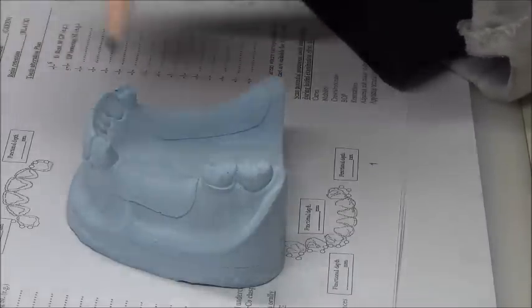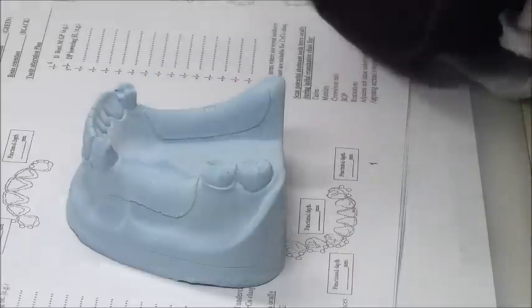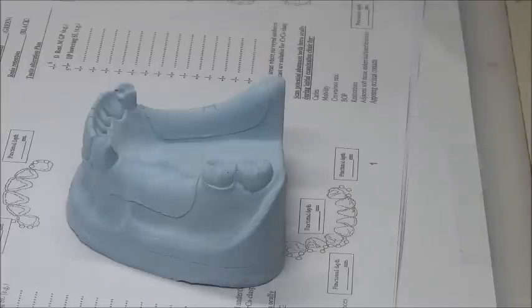Okay, we eliminated it, the guide plate is still there. Okay? While the molar, we kept it as a circumferential clasp. Okay. What did we put in the bounded saddle area? An open lattice or a mesh?